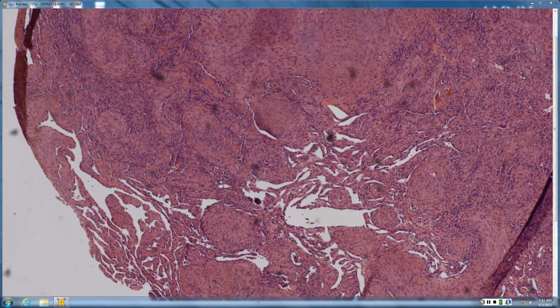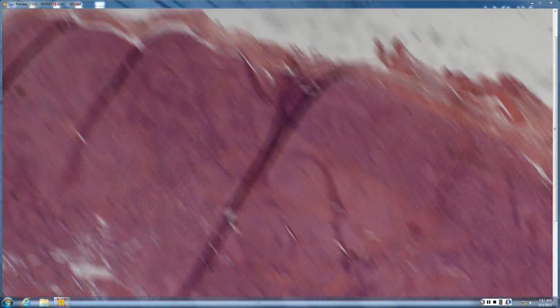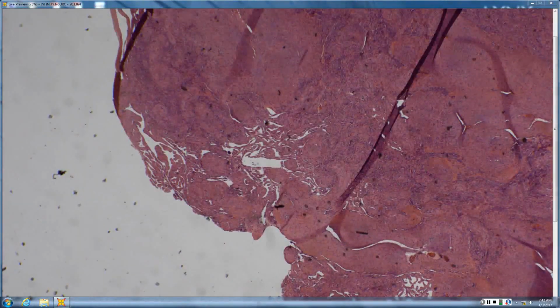So in what used to be hemangiopericytoma, what is now mainly solitary fibrous tumor, you have staghorn-like spaces in spindle cells. You were talking about hemangiopericytoma, or spindle cell hemangioendothelioma? That's what I thought. Okay, so hemangiopericytomas, most of which are now solitary fibrous tumor, have a patternless pattern of spindle cells, and staghorn-like vascular spaces, correct.